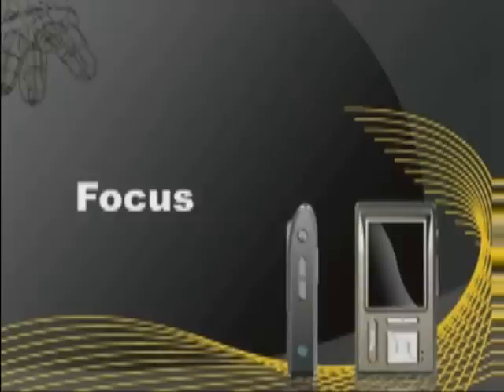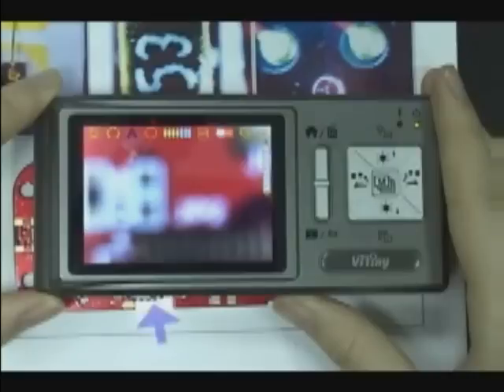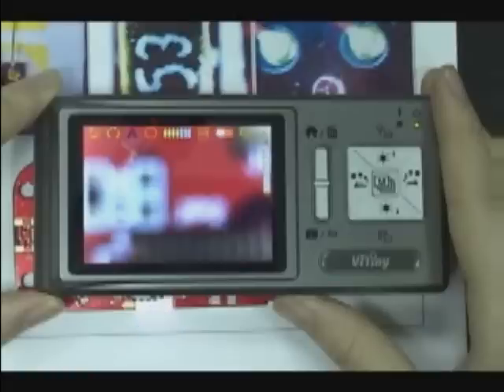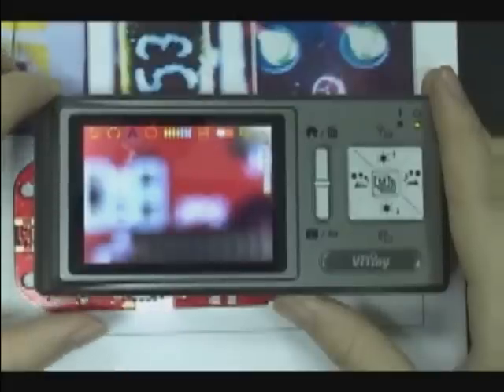Focus. Adjust the focus to make the image clear.